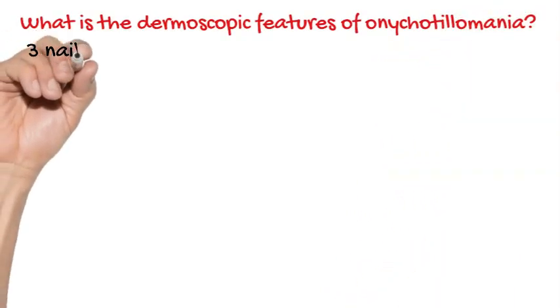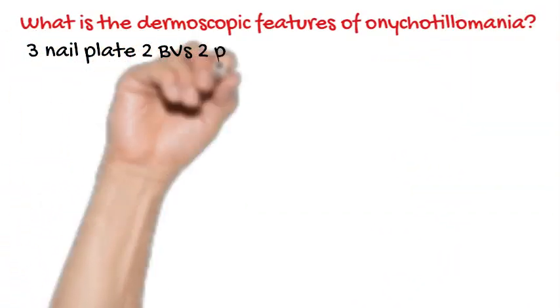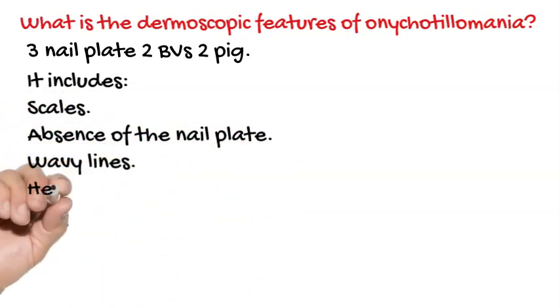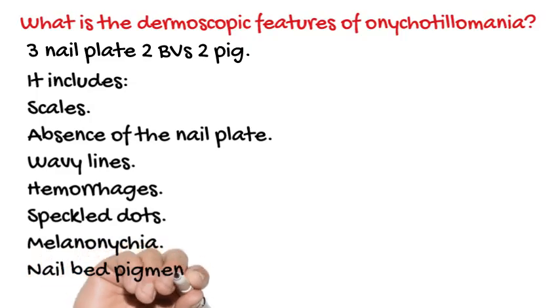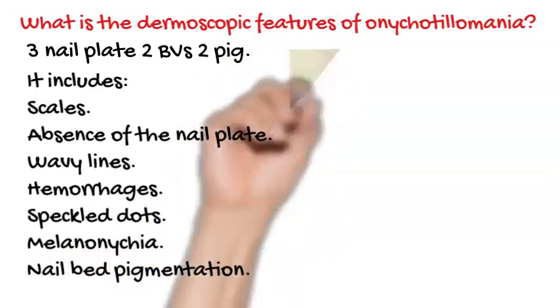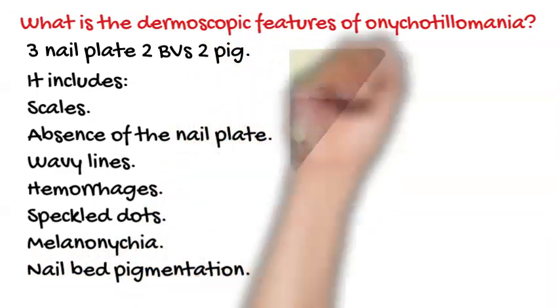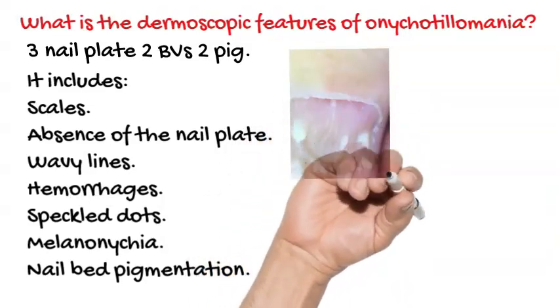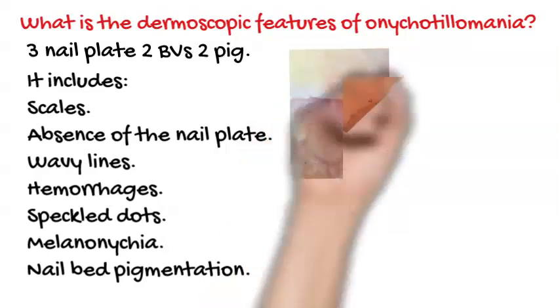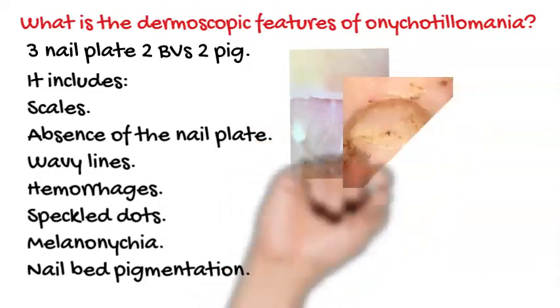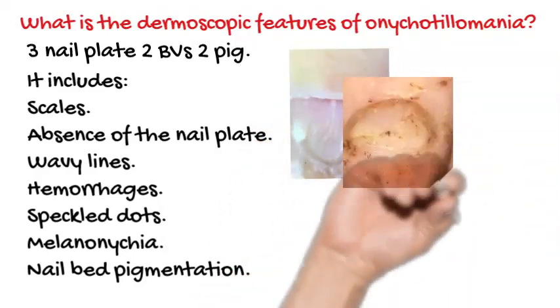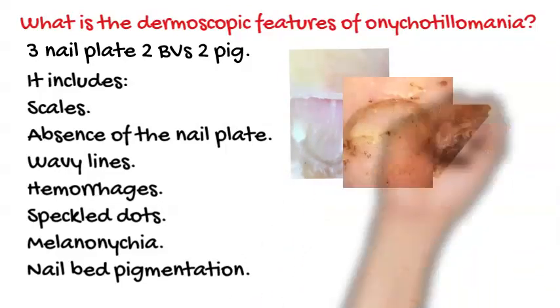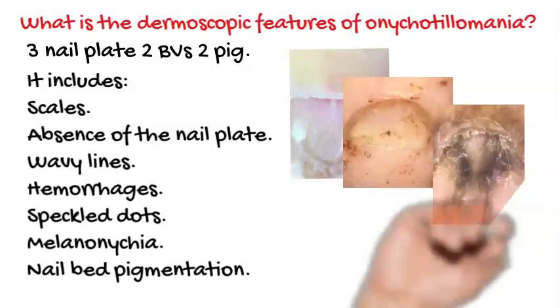We will describe seven criteria of onychotillomania on onychoscopy: three related to the nail plate, two related to blood vessels, and two related to pigmentary changes. The features are scales, absence of the nail plate, wavy lines, hemorrhages, speckled dots, melanonychia, and nail bed pigmentation.